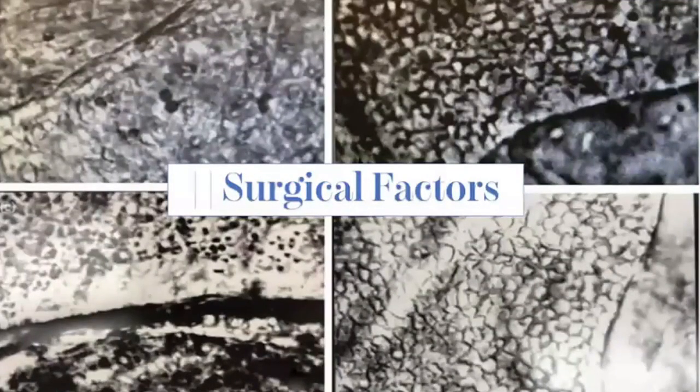In this technique, we don't score the Descemet like we do in DMEK and DSAEK, because when we score the Descemet, we create a trench in the stroma, and this would prevent the migration of the endothelial cells to the area that you want to repopulate.